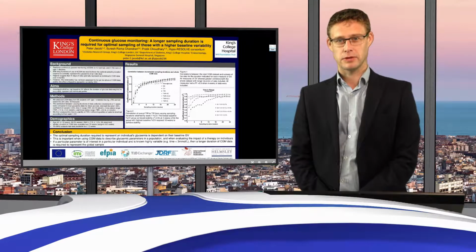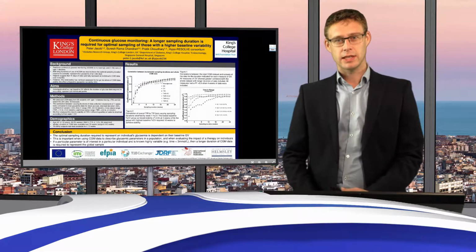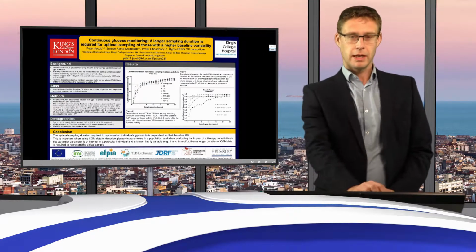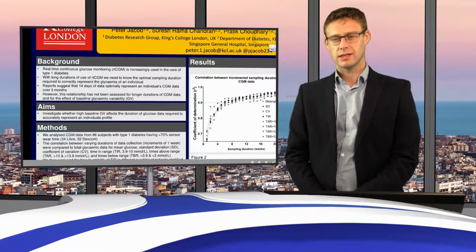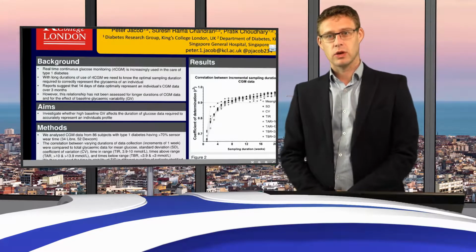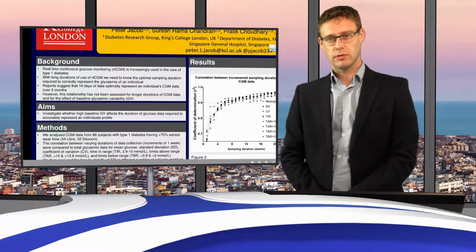I'm going to present my poster number 885 today on continuous glucose monitoring and the optimal duration of download required. We're increasingly using CGM in clinical services, but also in research studies as an outcome measure. Most commonly, short duration CGM profiles such as 1 or 2 weeks are used, because it's the standard preset on the software for downloading CGM. We ask the question, what is the optimal duration of CGM download required to be truly representative of the individual's overall glycemia?